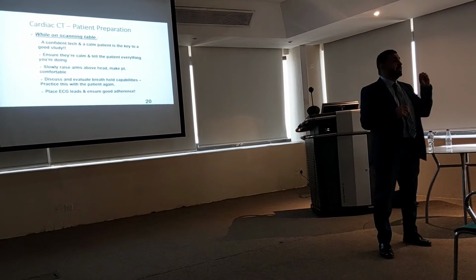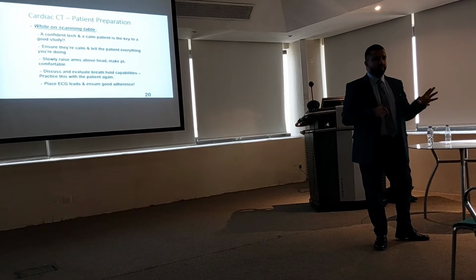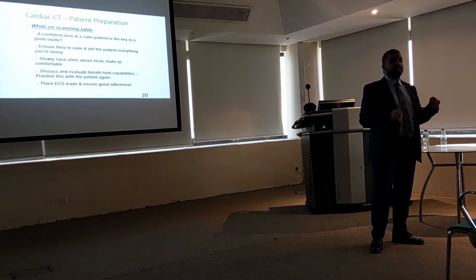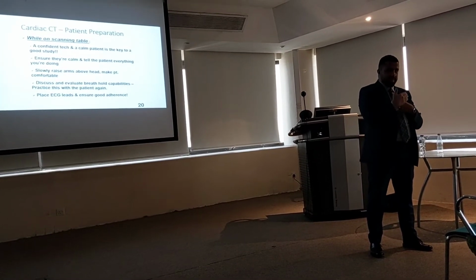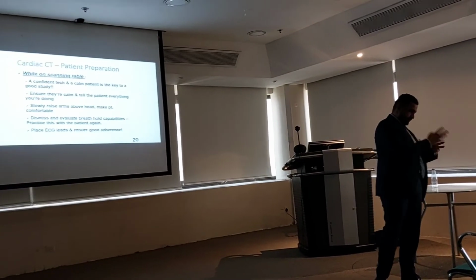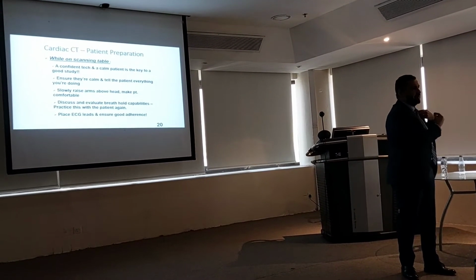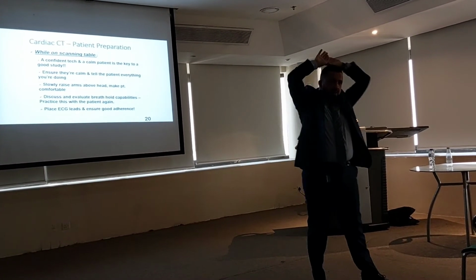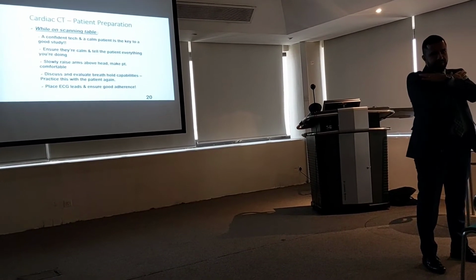One of the things that happened to me, especially with older patients, and not only older patients: especially in the beginning, when we are starting these procedures, it takes longer, sometimes 15, 20 minutes for the whole procedure, because you are preparing, discussing, checking, and then maybe the ECG is not ready yet, and then I'm coming back. If you keep a patient in the same position this way for 15 minutes, he will start feeling discomfort.